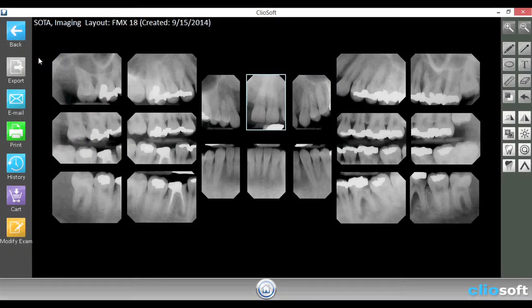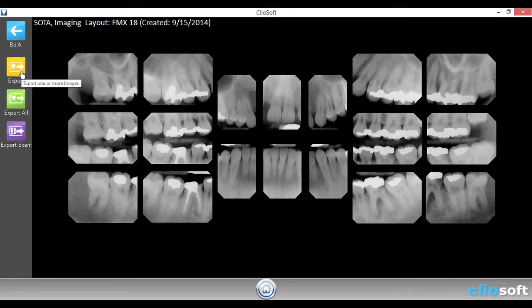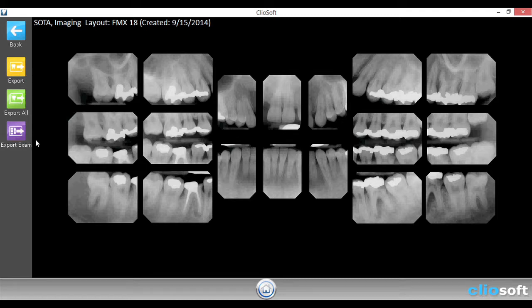Over on the left, you'll notice that you have three buttons called export, email, and print. All three of those buttons, once you get into them, will have the same three options. For this example, I will be using the export button. Once we get into the export button, you'll notice that it has export, export all, and export exam.